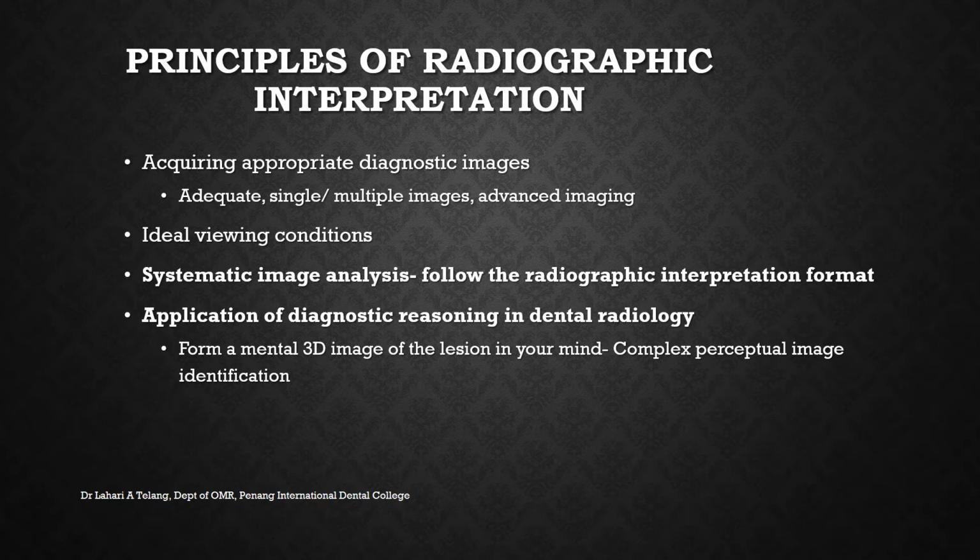Now, other than acquiring the appropriate diagnostic image, the next point is to have ideal viewing conditions. Also, systematic image analysis needs to be done. Especially for the novice dental practitioner or dental students who are trying to assess images for the first time, or who have less experience, it's important to follow a radiographic interpretation format.